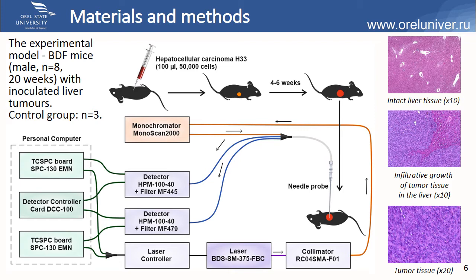Its distal end has 1 millimeter diameter, and it is designed to be used through a 17.5 gauge standard needle with a 20 degrees bevel. The optical measurements were followed by standard histological study to confirm the stage of tissues for processing the data.